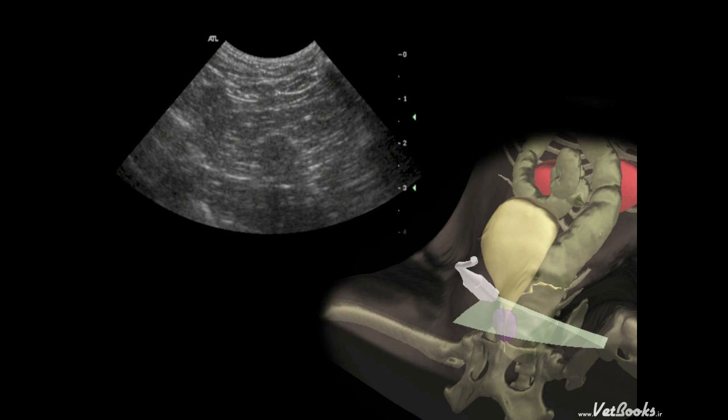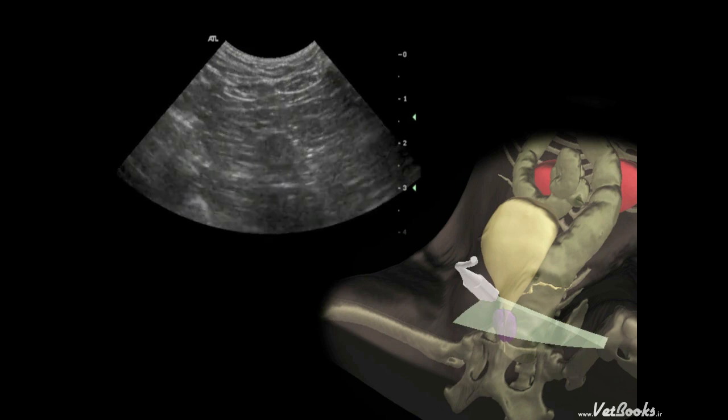A convex probe is generally more useful due to its smaller footprint that can be more easily moved around and pointed toward the pelvic canal. A linear probe can sometimes be used in certain patients, especially if its footprint area isn't too long and the prostate is located cranially.